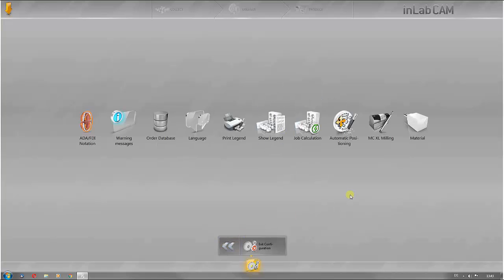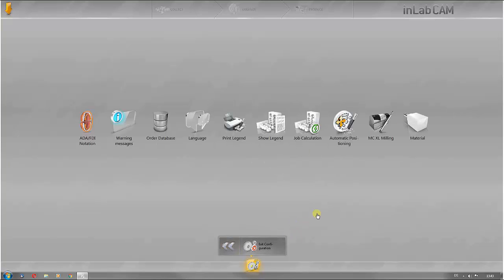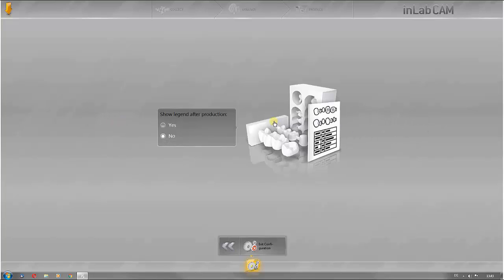The automatic job calculation summarizes the jobs automatically. It can also be set whether the legend of a job is displayed. This is always shown after production.